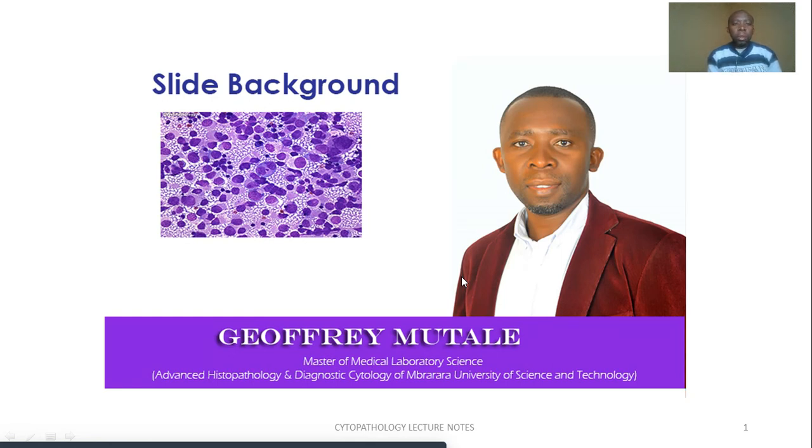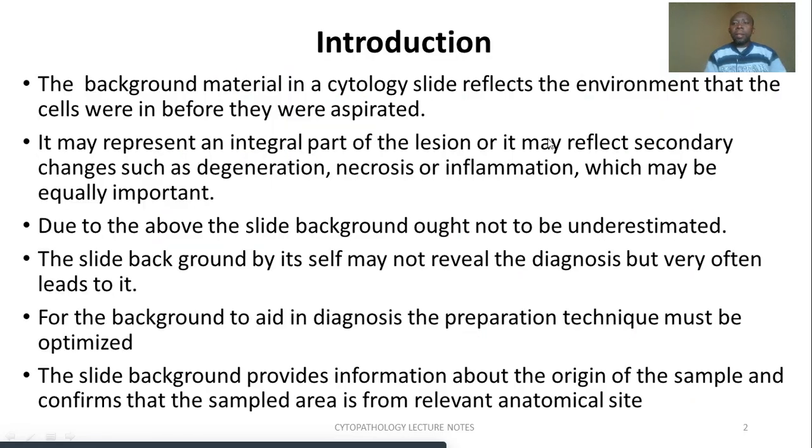So today we are going to be talking about slide background, and we have a few slides that we shall be going through to really understand what slide background is, how important it is, and how we can apply the interpretation of different backgrounds in our daily practice, and to have full knowledge of what cytopathology is. For those who are interested in my qualifications, just down below there you can read for your own satisfaction and contentment. But let's begin right straight away.